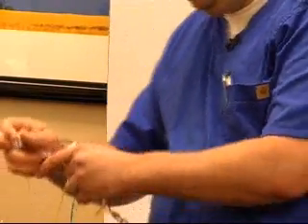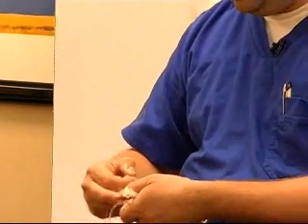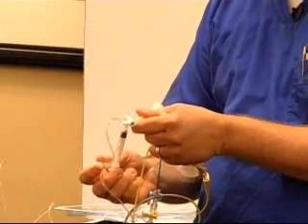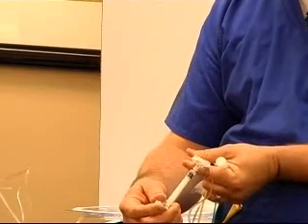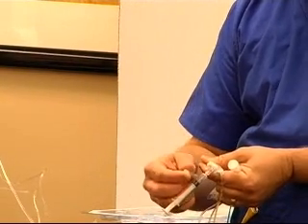And when you're talking about technique and the way that you go about drawing this, when you go to connect this, it just slides in there. When you're drawing this, if you could just point the tip up, you don't get air trapped behind the sample, okay? That kind of makes sense. Whenever you go to pull this back, the blood accumulates in the base of it so that it doesn't get this air trap behind it.